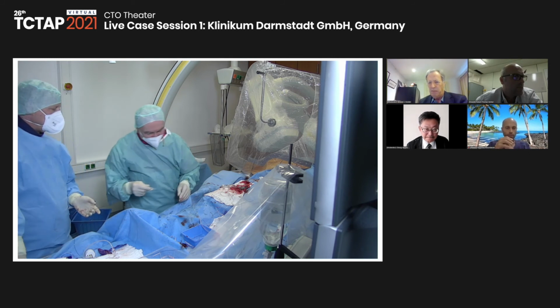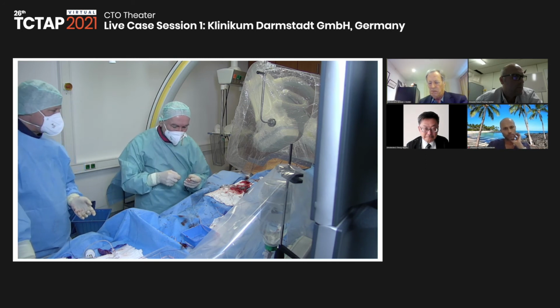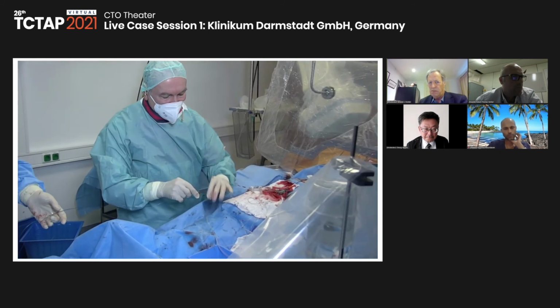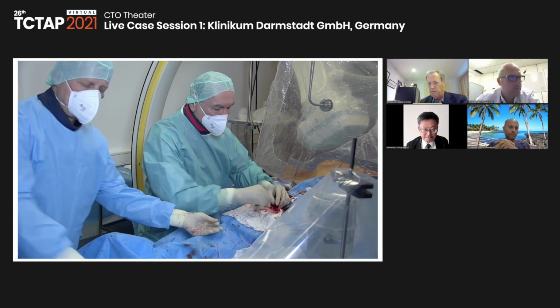Yes. So what I will do most probably is, according to the IVUS, put all the stents proximal to the crux, based on the RG3, and then go down and wire the PL and the PDA and do the final stent before removing the RG3.